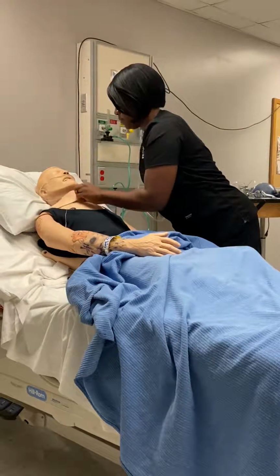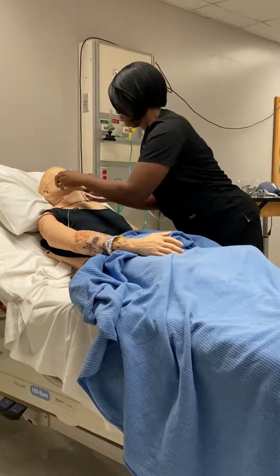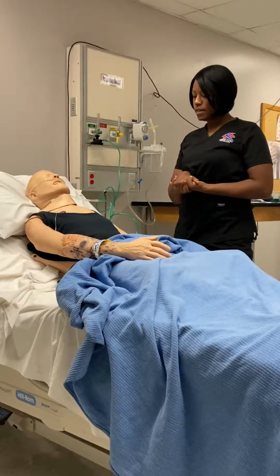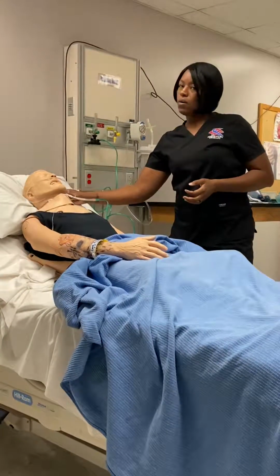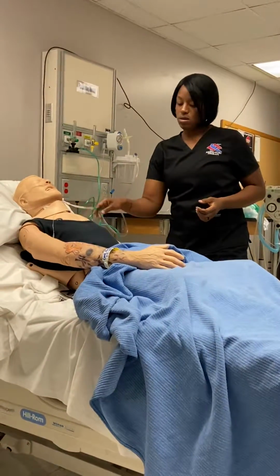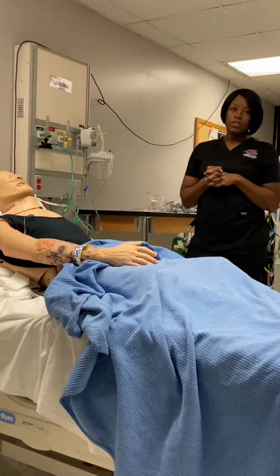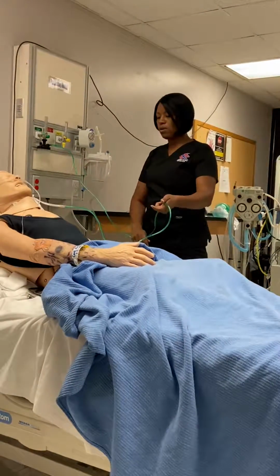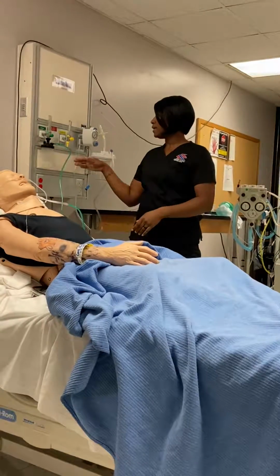I'm gonna loosen it up a little bit so it's not trying to choke you out. Okay, how are you feeling? Does that feel okay? The patient says yes. And so I'm going to check for the tubing, make sure that everything is going all right, make sure there's nothing blocking it.